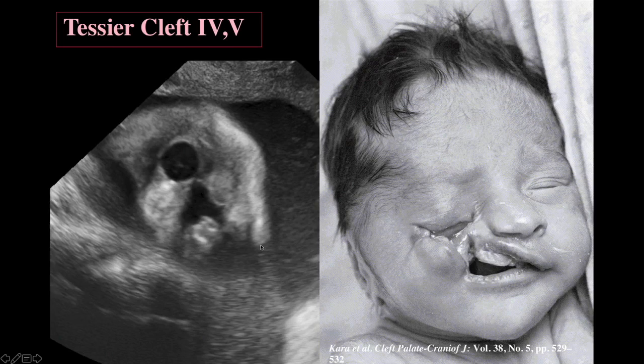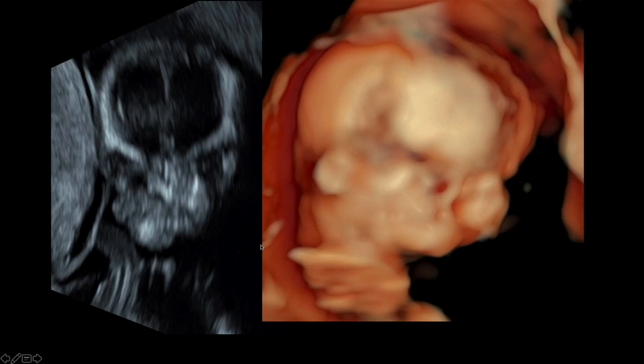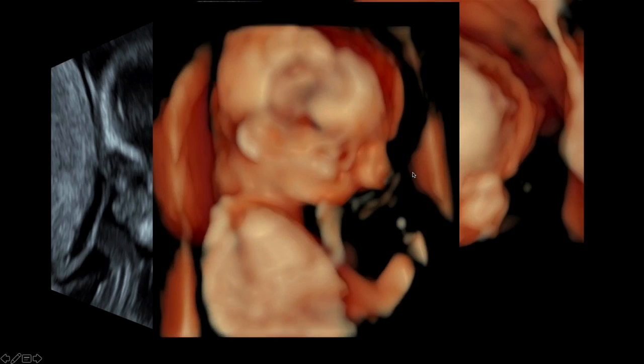We have seen a couple of them in the first trimester. Here's one that we saw in the first trimester, and once you've seen these, you can recognize them. They're really easily recognizable because the hole goes up directly from the mouth into the eye. Obviously, amniotic bands can do that too, so that would be the differential diagnosis, something really very destructive. But in this particular case, we never really did see a separate band, and this really qualifies very well for the diagnosis of Tessier cleft.